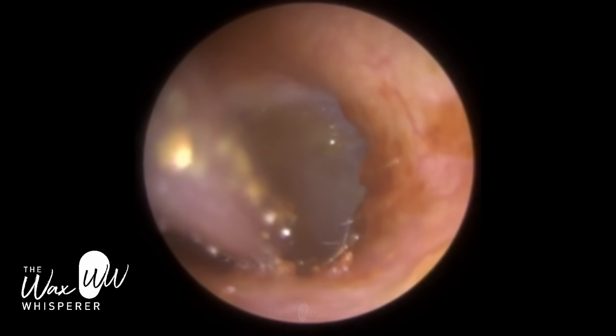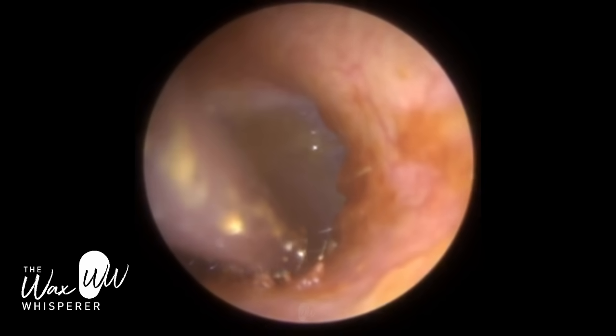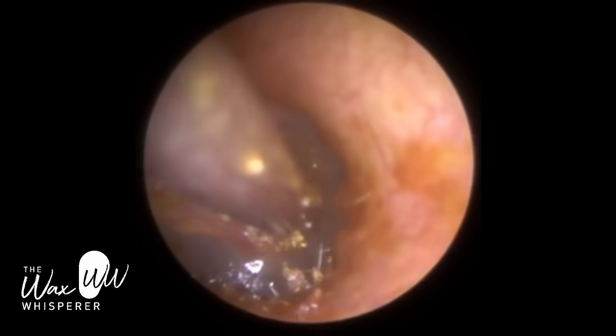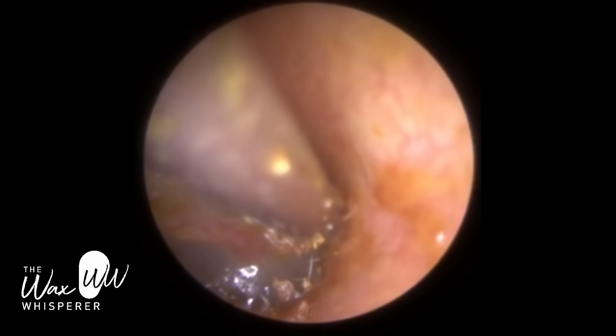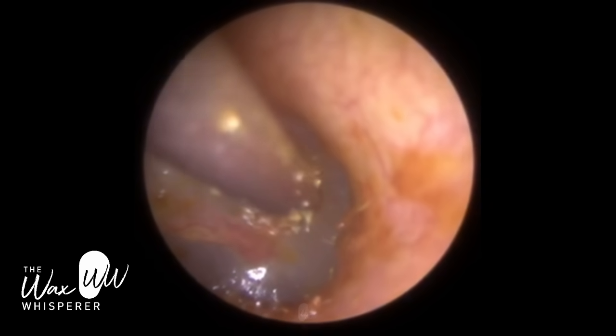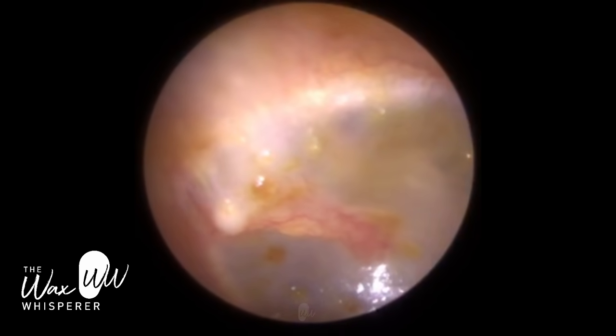Just using a fine end gauge - I think I've been pronouncing that incorrectly. Someone pointed me out; I've been calling it a fine end gorge, but it's actually gauge. So I do apologize. Just using a fine end gauge, size 18, just to mop up around the edge. We're not really too concerned by that - a bit of wax is actually healthy.